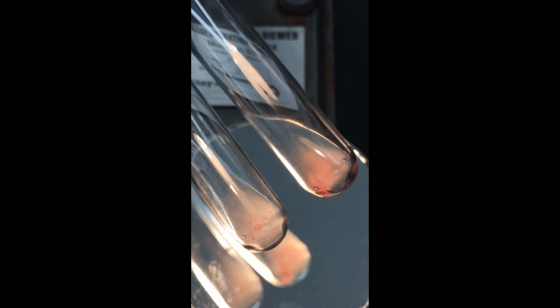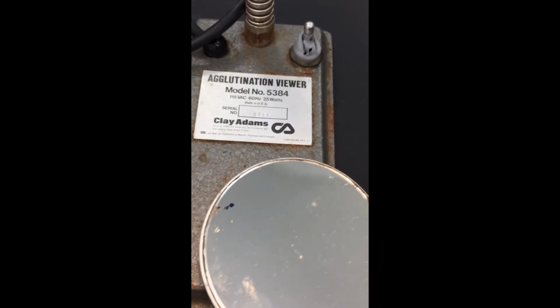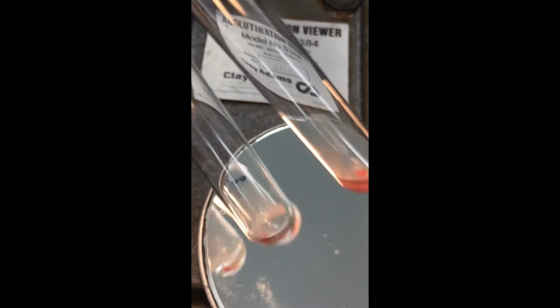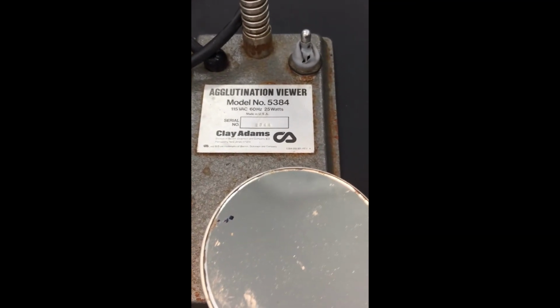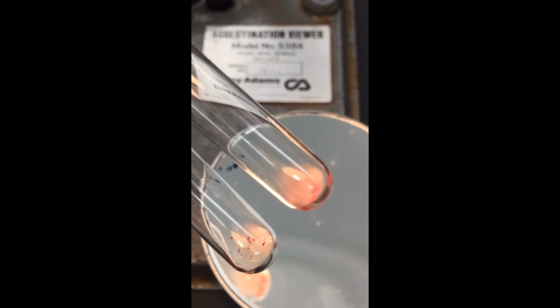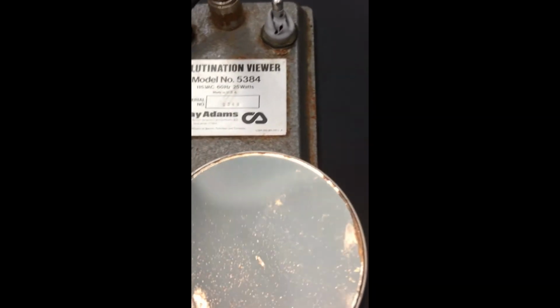Tube 13 is on the bottom in the left. This is 15 and 16. 15 is the bottom left, 16 is the top on the right. 17, 18. 17 is on the bottom. 18 is on the top. Tubes 19 and 20, sample C, AHG.